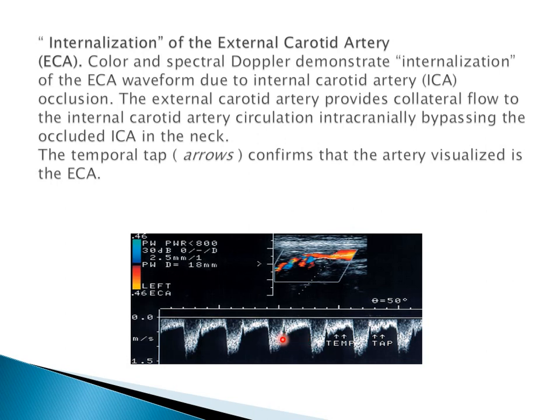Yes. Here is the external carotid artery. As you see, you have the peak systolic and diastolic. Even in diastole you have flow, so it will appear as a low resistance pattern.